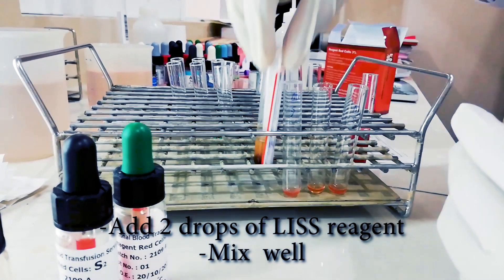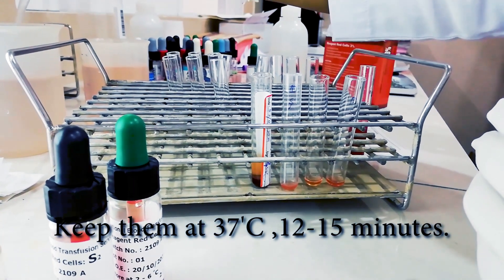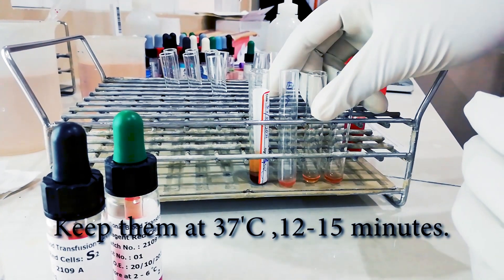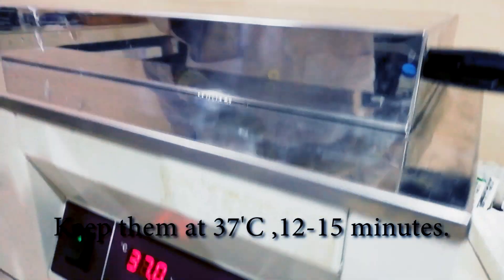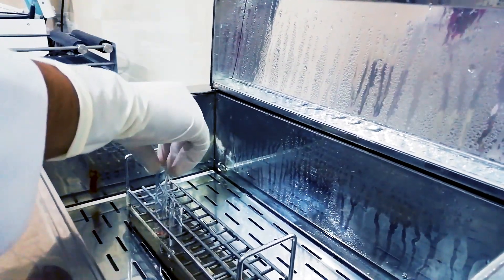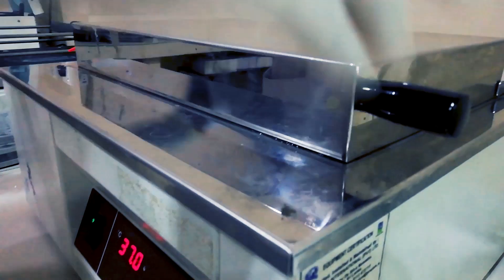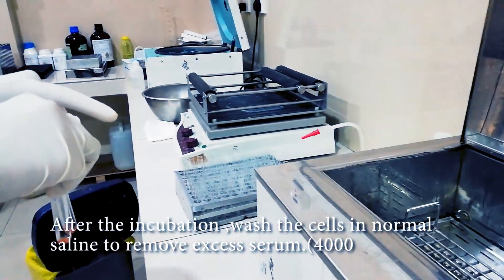Then we have to incubate these tubes at 37°C for 15 minutes. We will keep these tubes at 37°C for 15 minutes. After we take these tubes from the incubator, we have to do a saline wash.